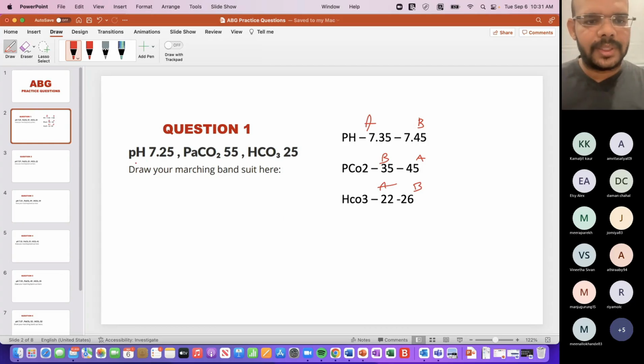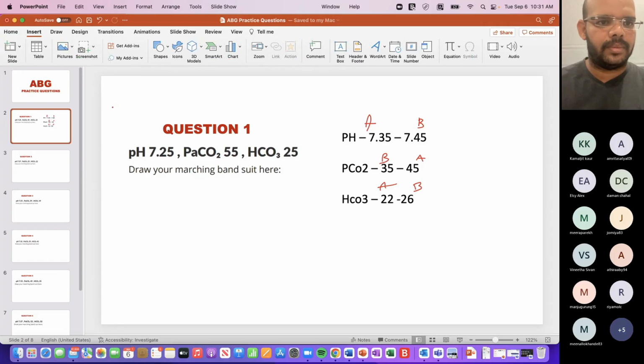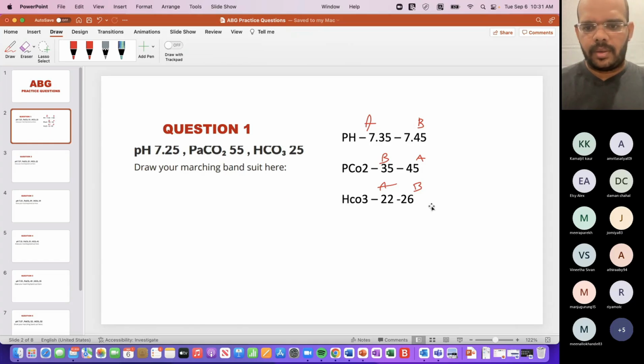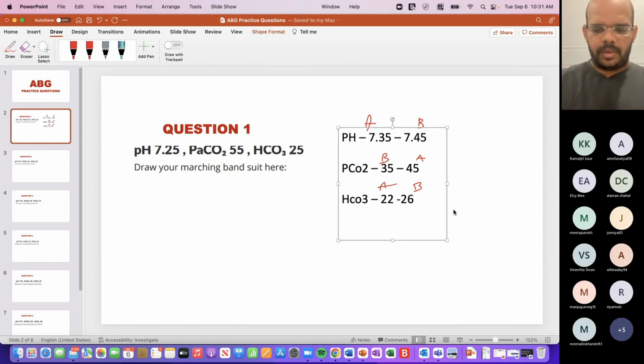Now put it here. pH is 7.25. It's acidosis. So pH is acidosis.